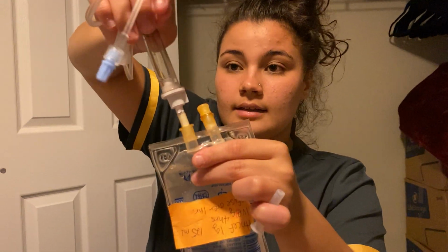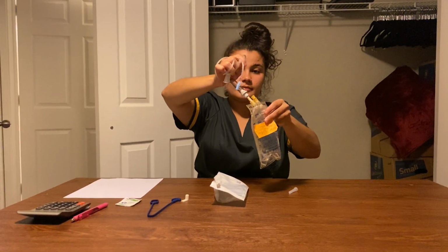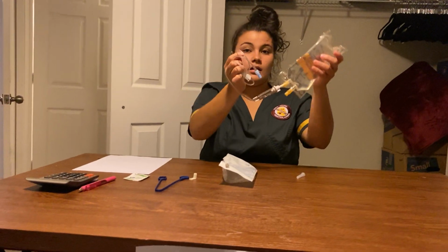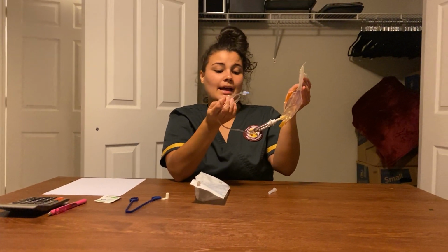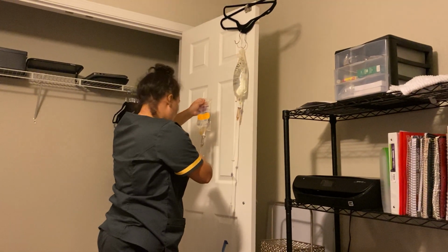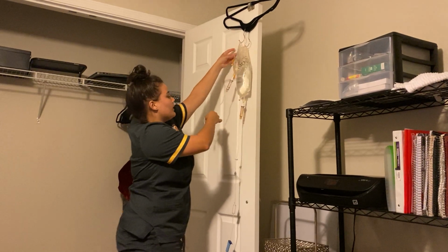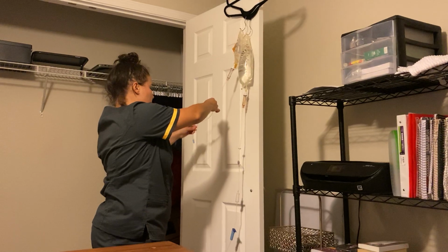Okay. Now what I'm going to do, I'm going to flip it upwards. Now I'm going to have to prime my tubing. So I'm going to go over here and hang this up right here. And I'm going to prime my tubing.